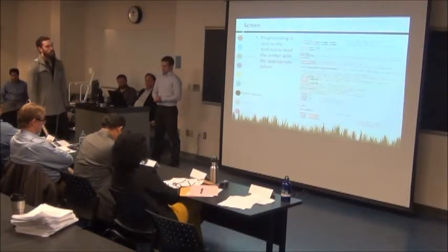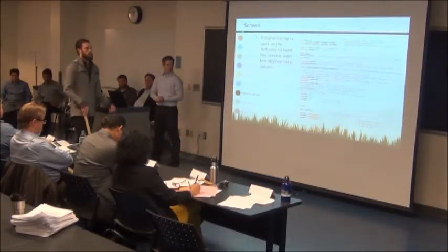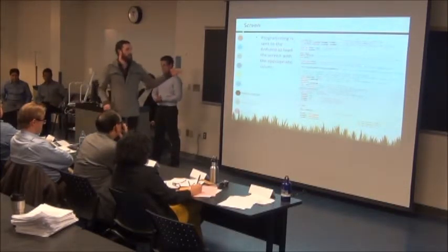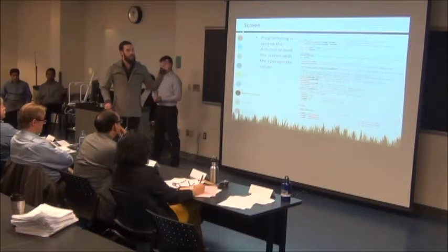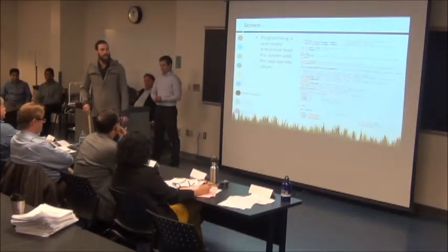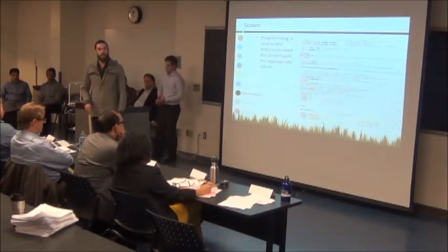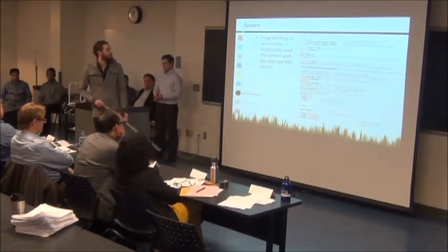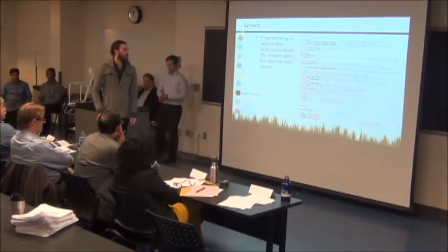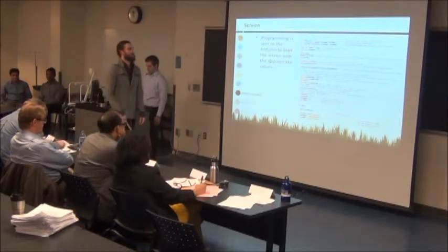So for example, we have 1.2 volts coming in from our circuits, and those 1.2 volts represent systolic. That's fed into the Arduino through this coding and output to the screen to show 120. So we just remove the decimal, add a 0, and we've got 120 systolic over 80, which is also represented by 0.8.